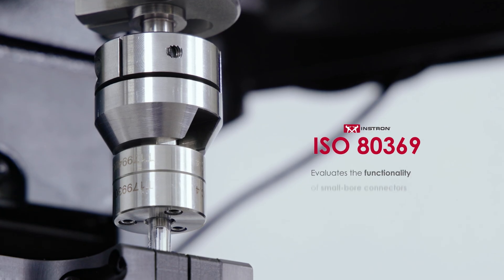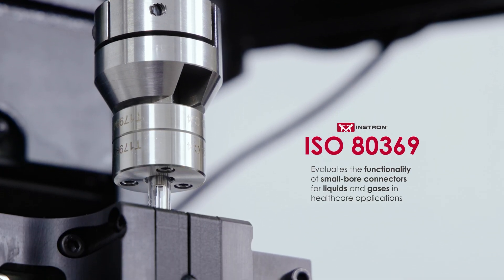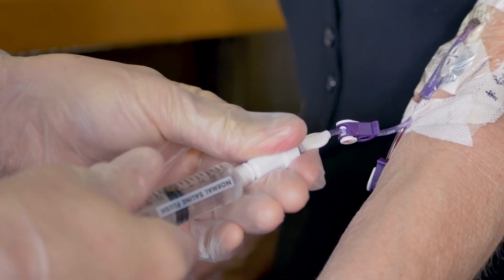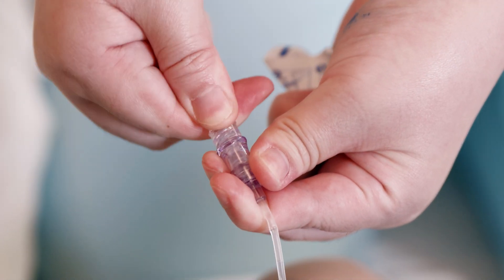ISO 80369 evaluates the functionality of small bore connectors for liquids and gases in healthcare applications. These connectors, also known as lure connectors, are universally used in medical applications to ensure that medical products such as syringes, catheters, and IV hubs will reliably connect to one another, regardless of their manufacturer.